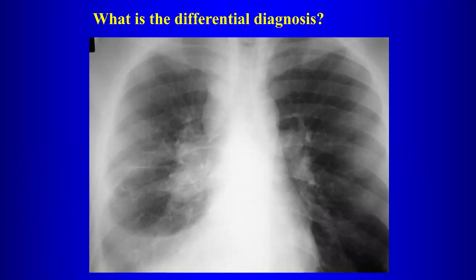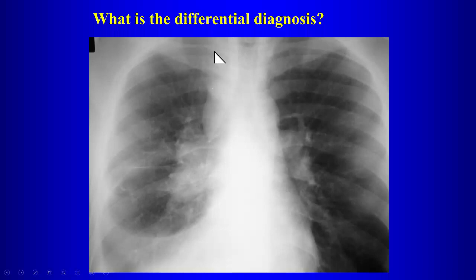On this radiograph, what's abnormal? There's right hilar lymphadenopathy — notice the left pulmonary artery is smooth while the right is lumpy and bumpy. There's also right paratracheal lymphadenopathy — too much density and opacity in that area. Additionally there is a right pleural effusion.